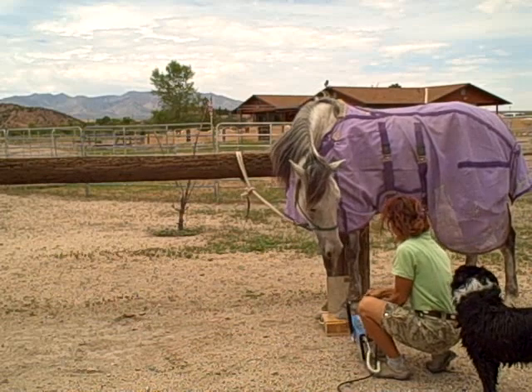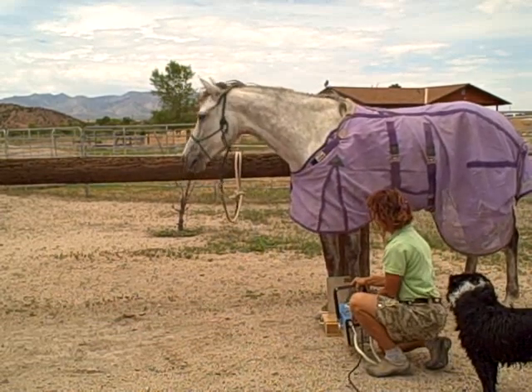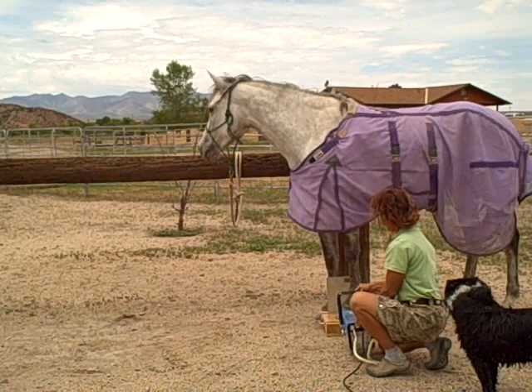Hopefully I'm not going to get a nose. We've lined up the two dots, and then you come down to line up on my foot.